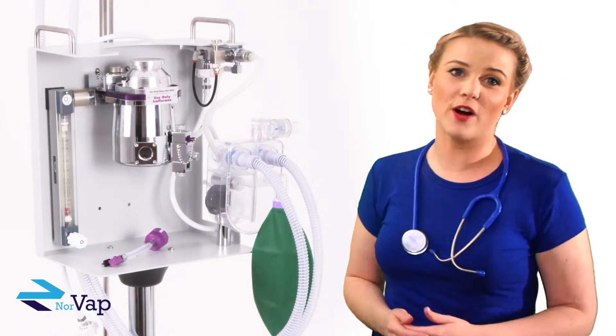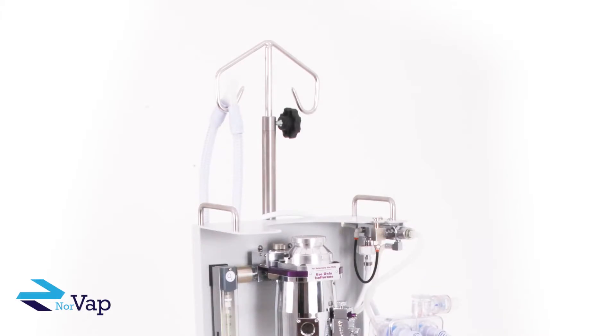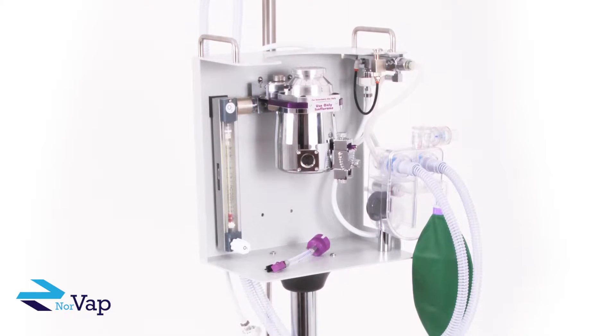This is our Orion 5 Anaesthetic Machine, one of the latest additions to our line of products. The Orion 5 is a bespoke machine which can be tailored to suit our individual customers' needs.